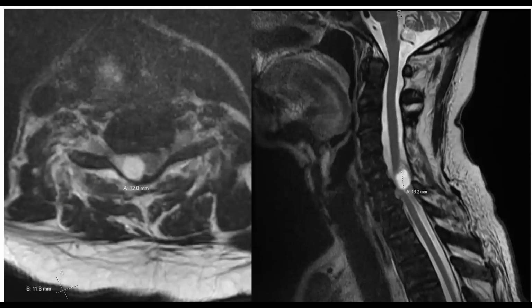And here it is. Beautiful T2 sequence showing this is a giant cyst compared to the size of this typical spinal schwannoma, dumbbell tumor going through the foramen. How gorgeous is that? Do you like this case? I could have started it either way. Many times it's difficult. I don't know how to play the cases, right? I just have to choose. This would have been a great scan to start with, wouldn't it? Maybe I'll do that in 6 months and see if anyone remembers it, right? We'll start with a slightly different cut. Isn't that great? Cystic schwannoma.